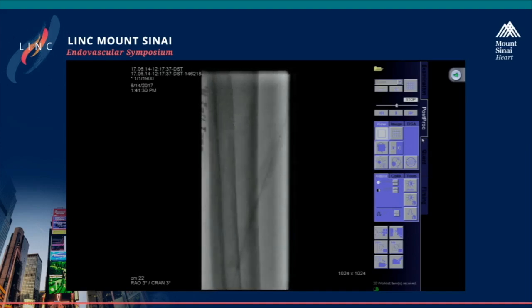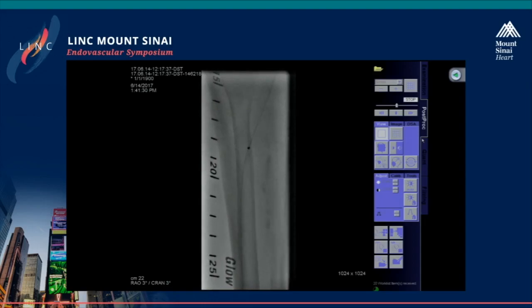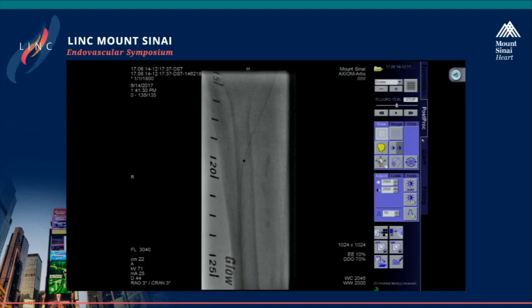And so I think from a concept perspective, removing plaque by whatever means is probably a good concept, which then likely will need to be followed up by some sort of drug delivery or additional treatment. The problem is we don't know at the moment whether our tools are doing the job or not, but I would think the laser is certainly an option.